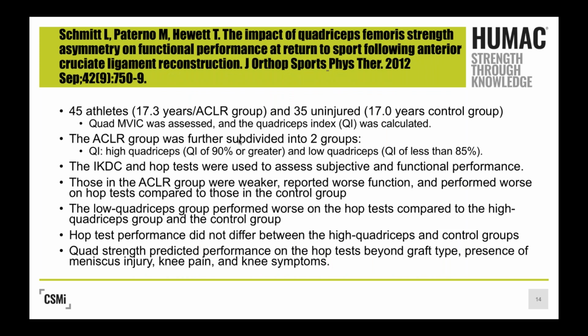All right, so I got a group here that did my next 5 studies, and we'll go through these quickly. This was interesting how they did this. Again, this next group of studies were performed by the same group of researchers. In the first 3 studies, they compared patients who underwent ACL reconstruction at the time of being cleared for return to sports. So everybody that was included in these was cleared for return to play.